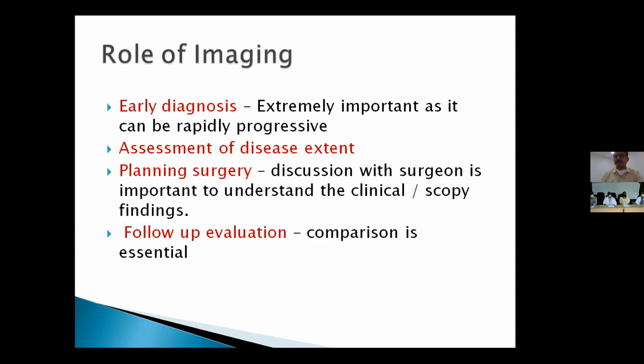Assessment of disease extent. This is important because management differs depending upon the extent of the disease. When the disease is confined to the sinus cavity, management is different. It needs only endoscopic sinus surgery and antifungal administration. When it spreads to the orbit or masticator space, infratemporal fossa, or intracranial extension, management differs entirely, and it needs a multimodality approach for treating this patient, which might be gruesome for them.